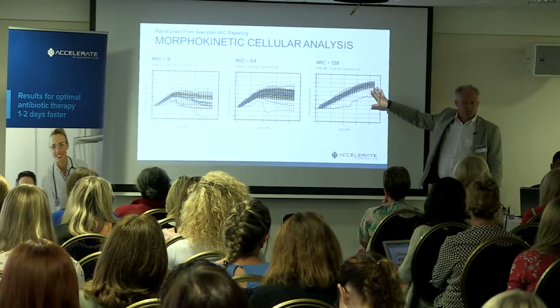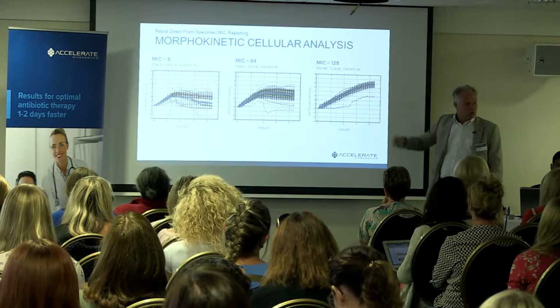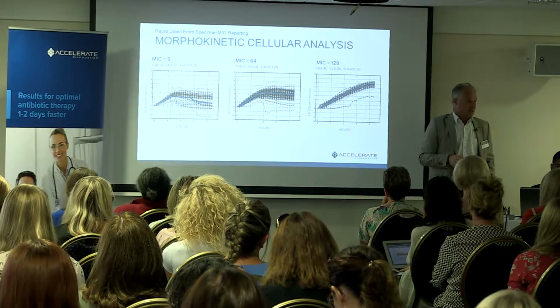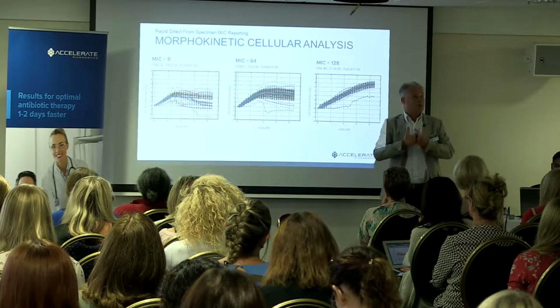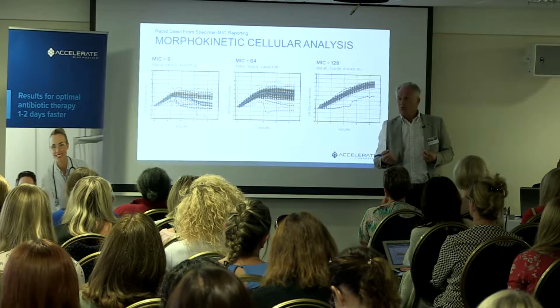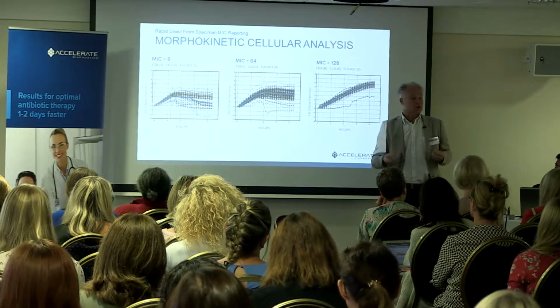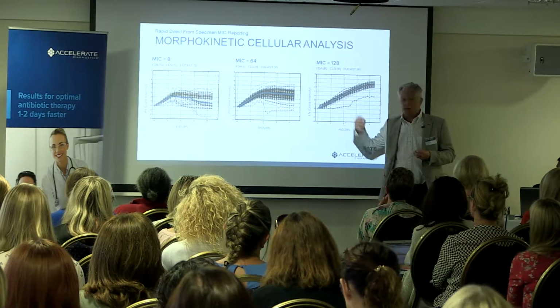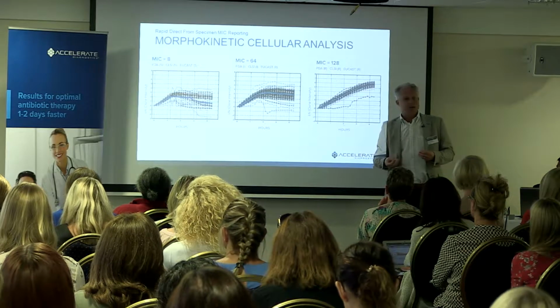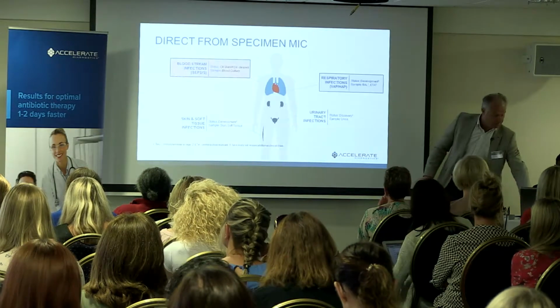As I said, we use about 13 of them, compared to a huge database of known strains, antibiotics and MICs. You could compare it to a certain extent to what's happening with the MALDI-TOF, where you have all these profiles for the identification. We have generated in our database profiles for MICs. And the system has been trained to give the MICs as given by broth microdilution as the standard method. So that's what we use to train our system.